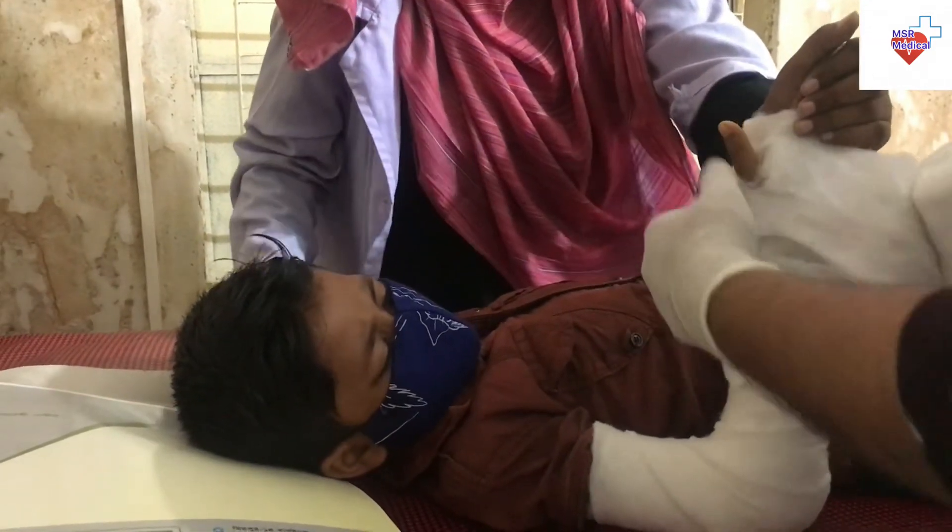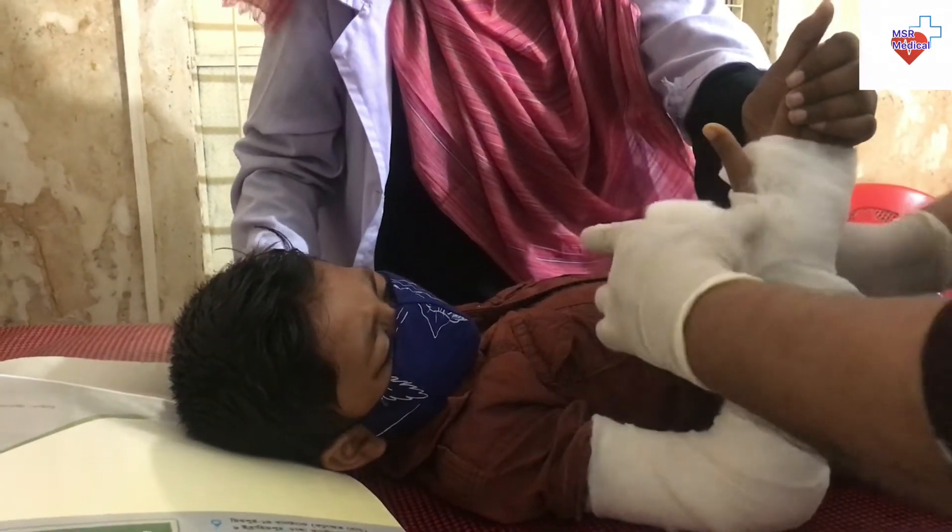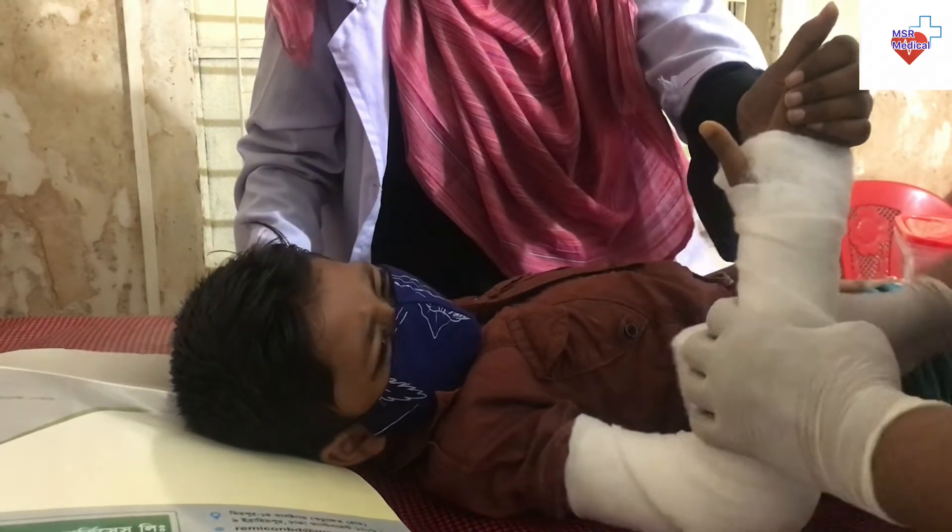Ensure that there are two layers of soft roll on the hand, extending no further than the palmar crease to leave the metacarpophalangeal joints free.